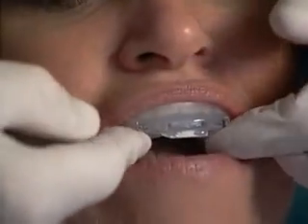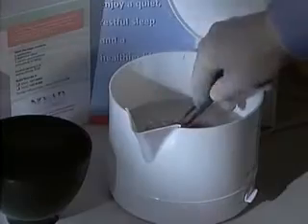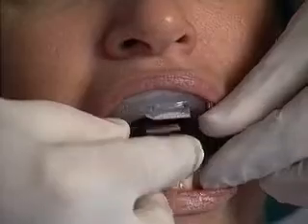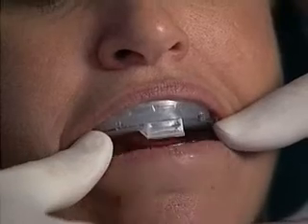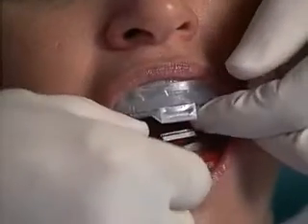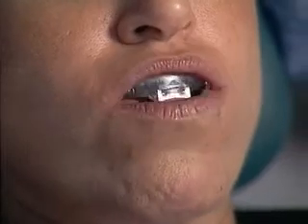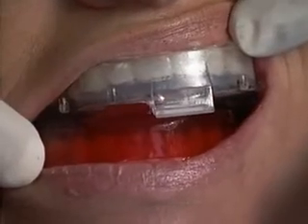Now you're ready to fit the lower device using the same procedure. Place the lower colored device in boiling water for 3 minutes, then remove and cool for 30 seconds. With the upper NORAD in place, insert the lower device in the patient's mouth. Initially seat the lower with light pressure, and then have the patient bite down firmly against the upper device. Allow both upper and lower to remain seated for 5 to 10 seconds. Remove the lower device, cool it further underwater, and immediately reseat it. Have the patient purse their lips around the entire appliance, and leave both devices in place for about a minute.